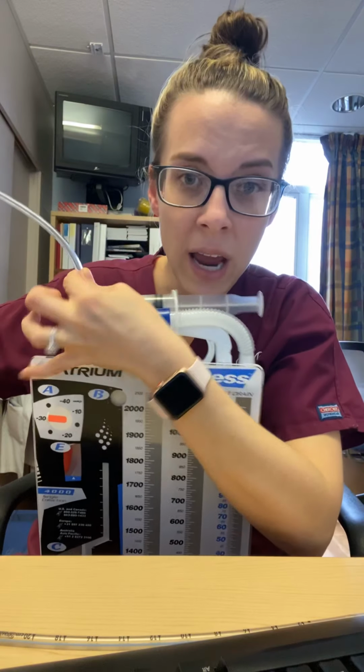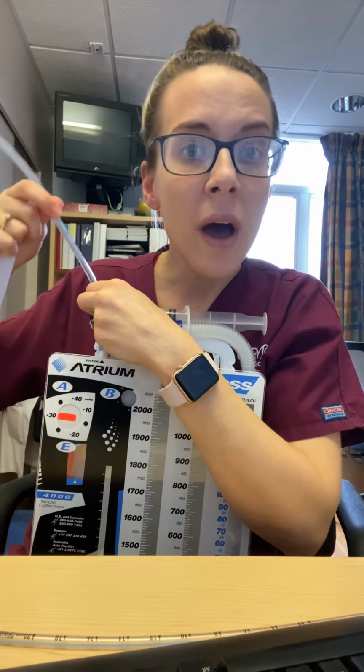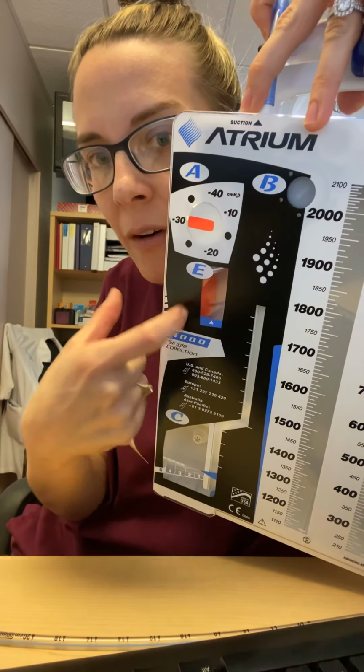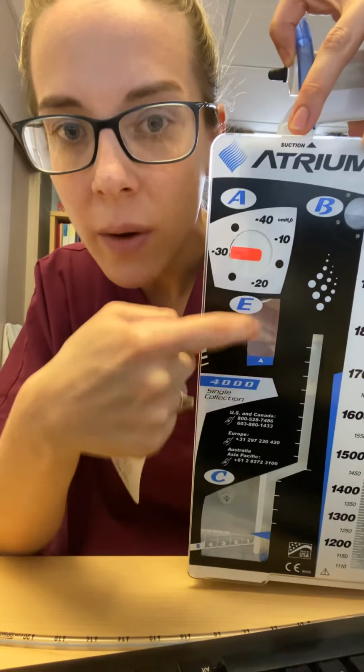to the pressure gauge on the wall. And the way to know that you have adequate pressure coming from the wall is you'll see this little orange balloon. See how it's flat right now? It'll actually pop open into the window where this arrow is.